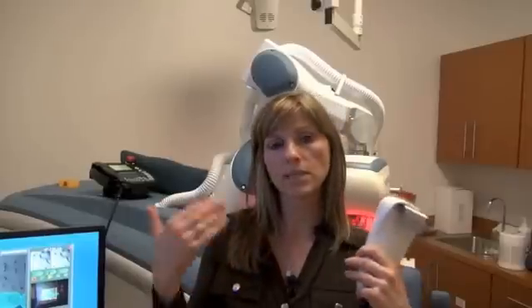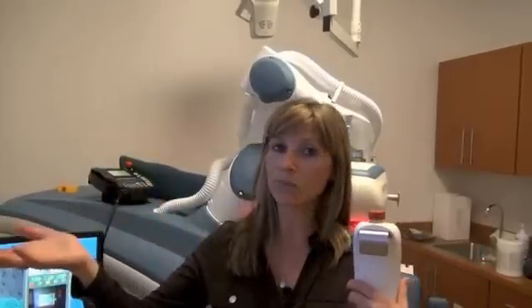The system is interactive. We tell the system what we want it to do, and it maintains that, but at the same time it can think through the process.